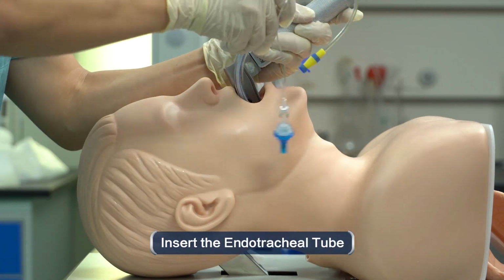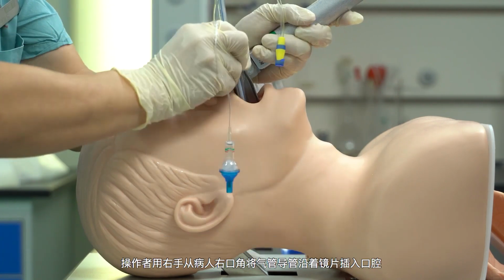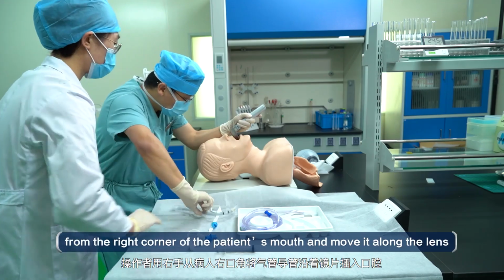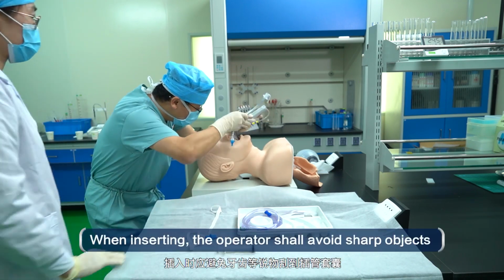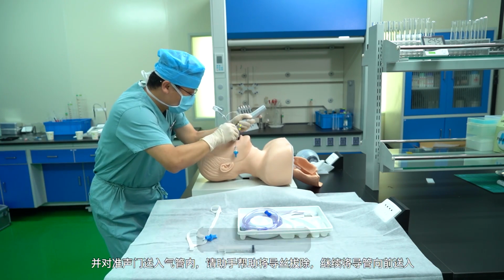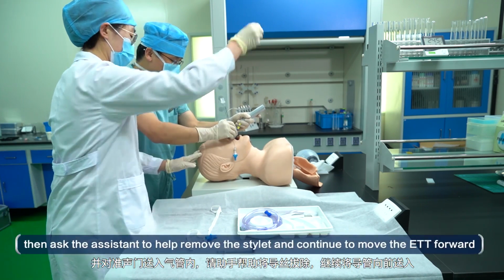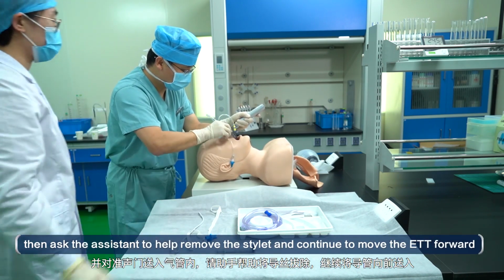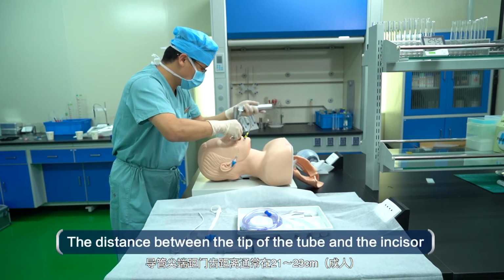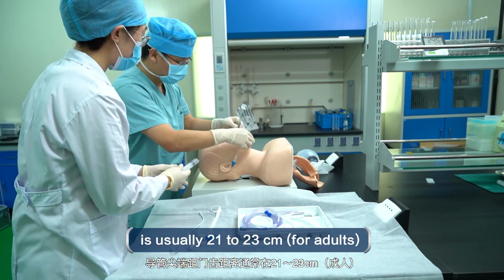Insert the endotracheal tube. The operator uses his right hand to insert the endotracheal tube into the oral cavity from the right corner of the patient's mouth and move it along the lens. When inserting, the operator shall avoid sharp objects such as teeth from scraping the cuff. Next, send it into the trachea while aligning with the glottis. Then ask the assistant to help remove the stylet and continue to move the ETT forward. The distance between the tip of the tube and the incisor is usually 21 to 23 centimeters for adults.